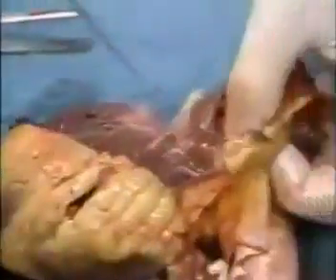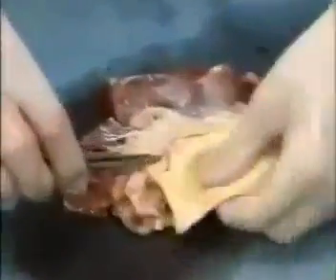The outflow tract to the pulmonary artery is normal, and the 3 leaflets of the pulmonary valve are intact and normal. This is the aorta she's opened, the aortic valve, and you can see the 2 coronary ostia where the coronary arteries come off from the aorta, just above the valve cusps.